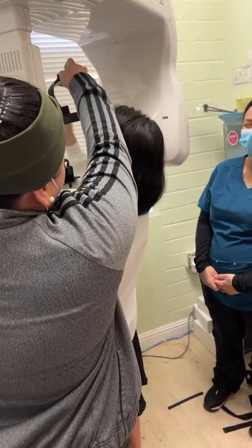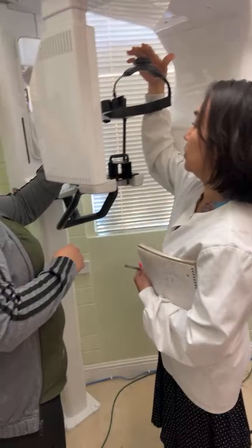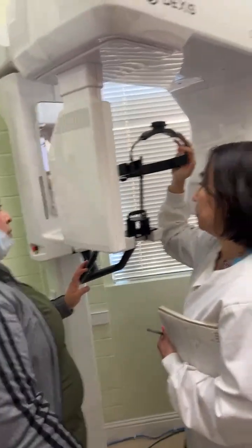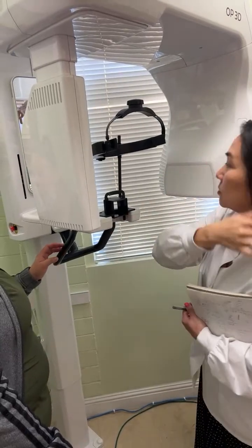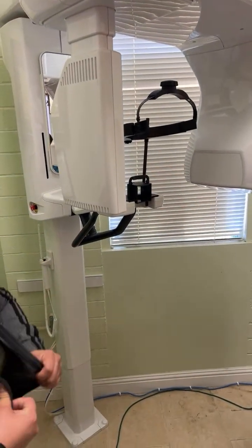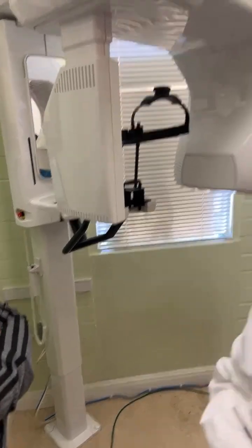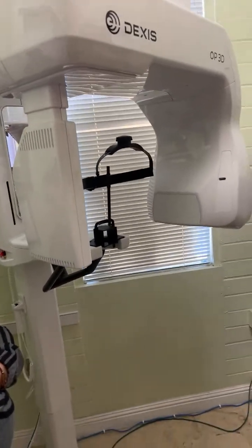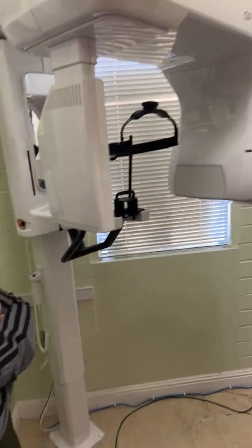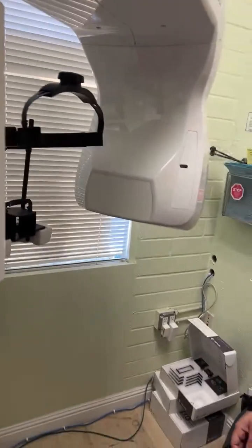That's all there is to that positioning device. It's pretty simple. Before you move that, you unhook this one, remove this and then this. That keeps them stable. Stability of the head is key on high res especially. Standard or low dose, not as critical. But I want you guys to be consistent. You want to try to move it around because this thing is kind of new to everyone.